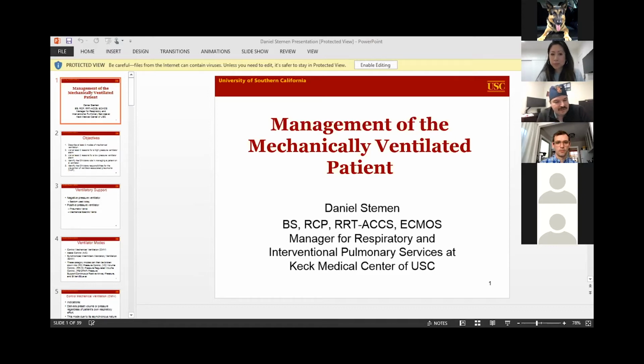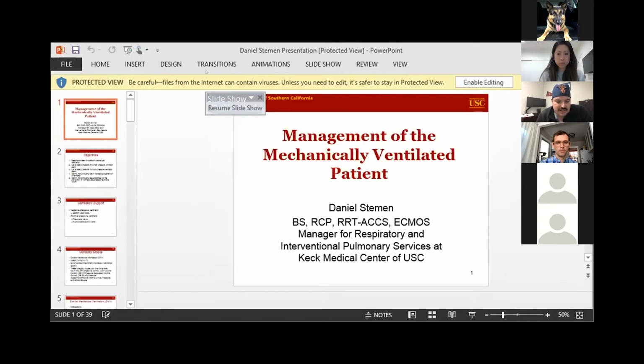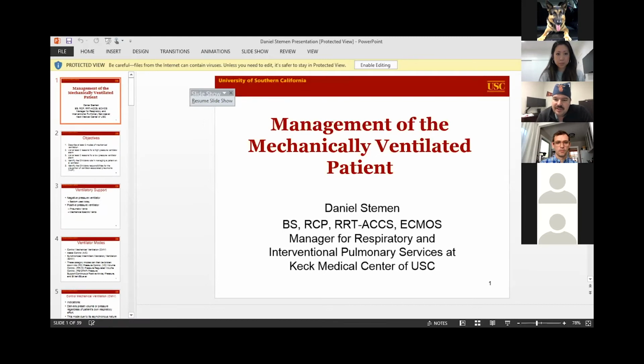As many of you may know, there are many types of ventilators with a lot of software these days that govern the different strategies for ventilating a patient. The key thing I want to go over is what we're looking for in this emergency surge environment: some minimums for useful devices in this space. Since COVID causes issues that would not be overcome with just a ventilation component, we need to focus on devices that can provide high levels of mean airway pressure and therapeutic pressures to provide oxygenation support to patients.